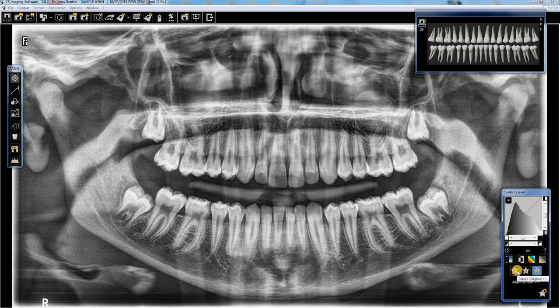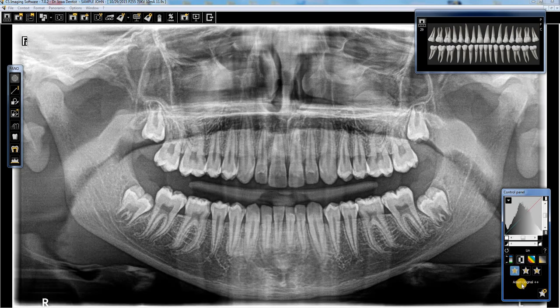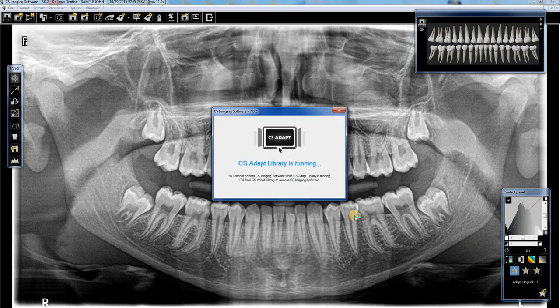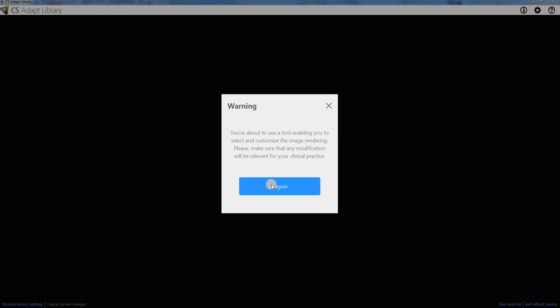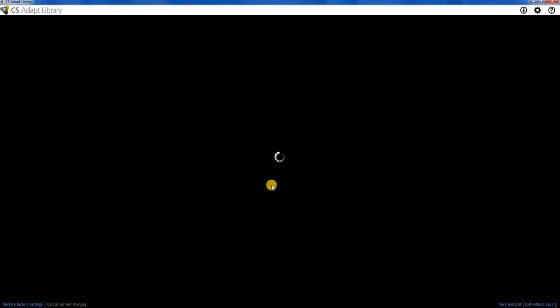But if we wanted to change one of these, we're going to click on our little star with the gear. That's going to launch CS ADAPT.